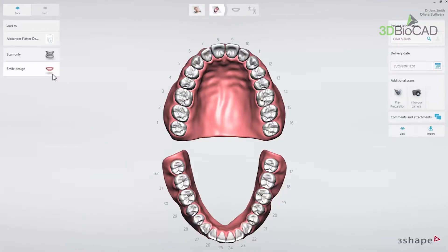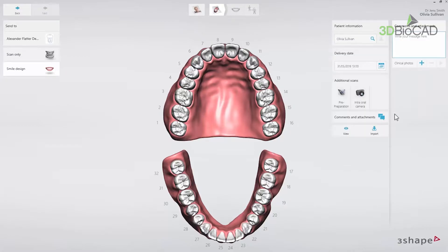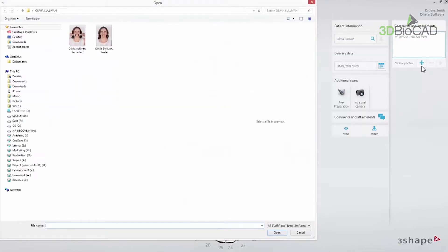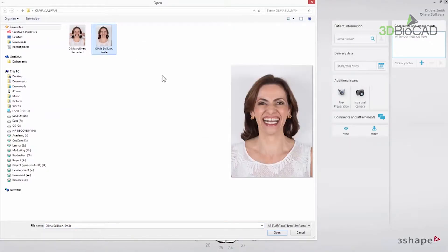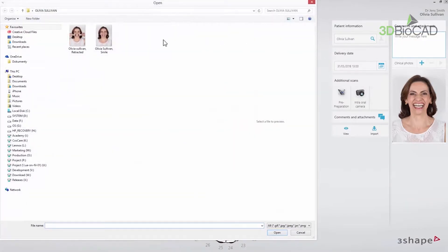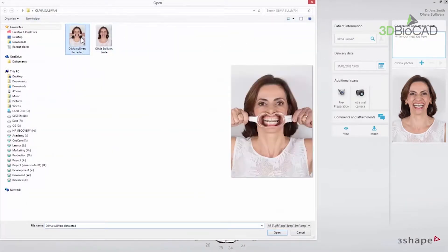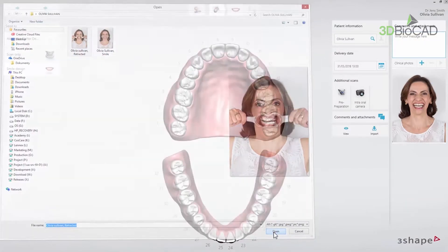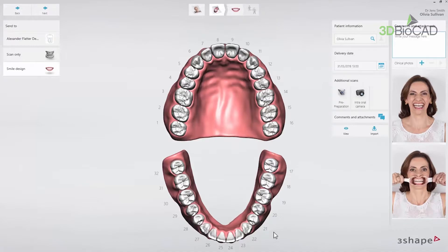Since Smile Design is a treatment planning tool, you do not have to choose any indications. Click the Comments and Attachments tab and add clinical photos of the patient. Smile Design can be used with a smile photo alone or with both a smile and a retracted photo. The retracted photo is needed if the patient does not show the gum when smiling. In this video we will demonstrate how to do a design using both photos.